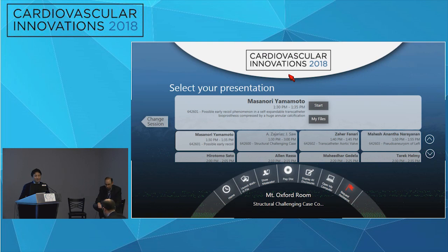So perhaps, for cases where you're planning not to do post-dilatation, would you now routinely do an additional angle of fluoroscopy, or do you think it's an issue with the echo that you didn't get a really good image to visualize it very well? Yeah. First of all, I should check the RAO view after the post-dilatation, and also confirm with the echo. Of course, the previous echo showed the incomplete dilation like that. So if we see it open a little bit, it's acceptable. And we should check the pressure gradient.